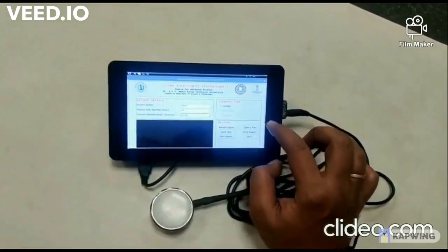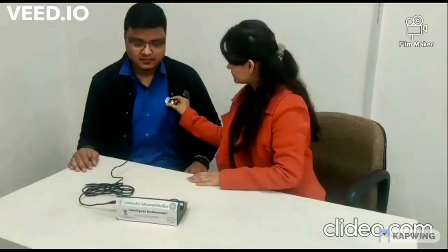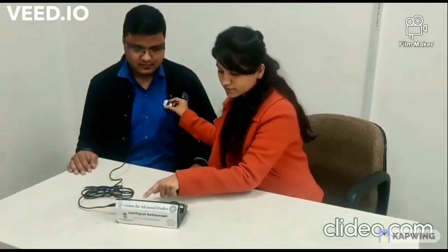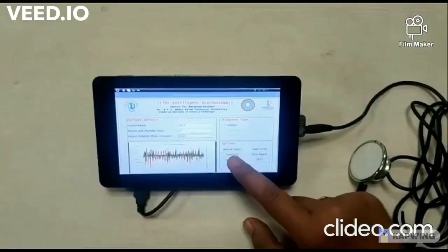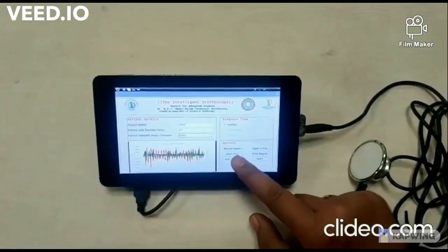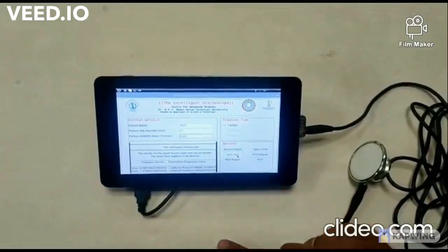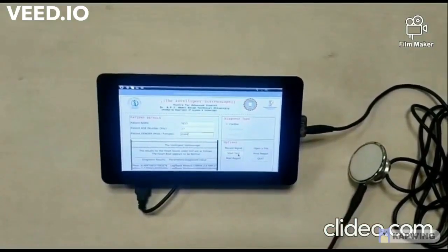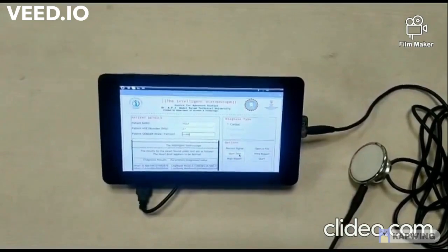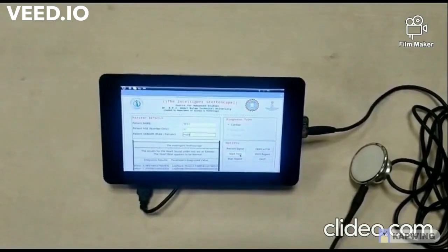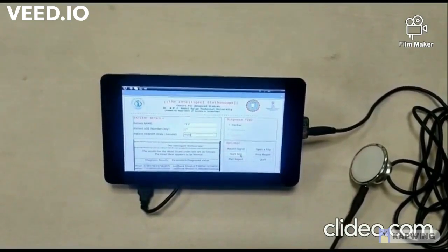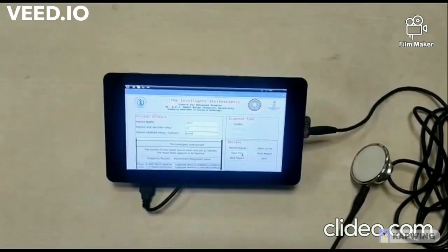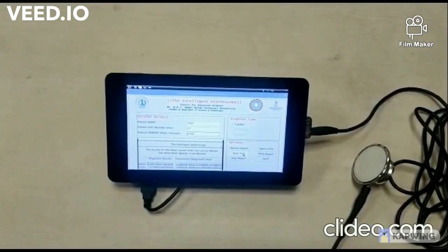Place the chest piece to record the signal. Click on record signal — the signal has been recorded. Click on start test — the reports will be displayed on the GUI.